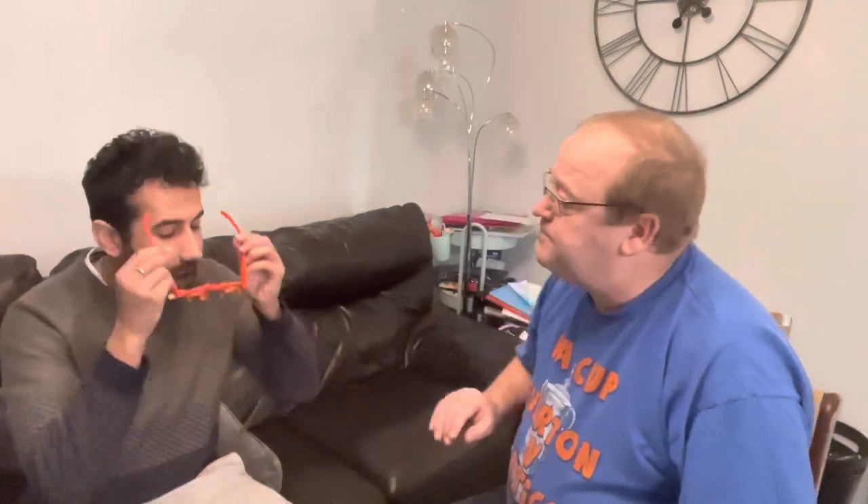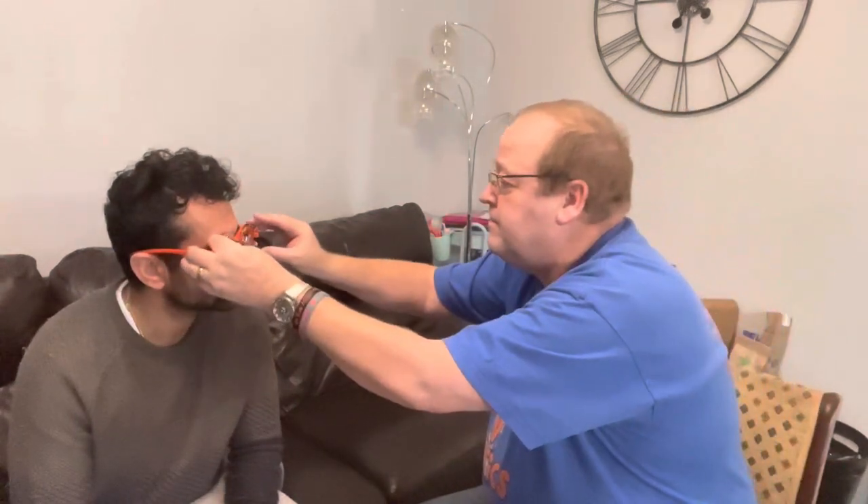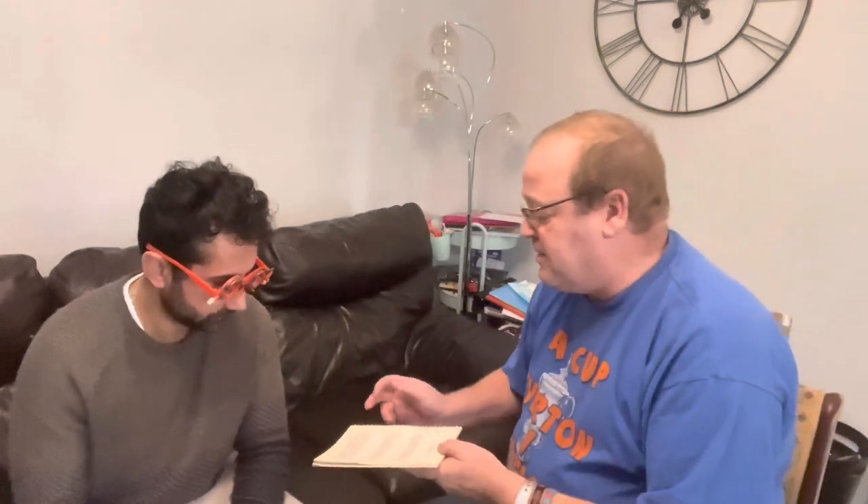If you'd like to put that on for me. How does that feel? Does it feel alright? It's not too bad, thank you. Excellent. So your reading prescription is plus 125 at the moment, so I'm just going to put those lenses in and I'll get you the reading card. If we concentrate on the N8 — put that at the working distance that you would normally read. I'm just going to measure that distance. That's 30cm. Now what's the smallest you could read on that page, if any?